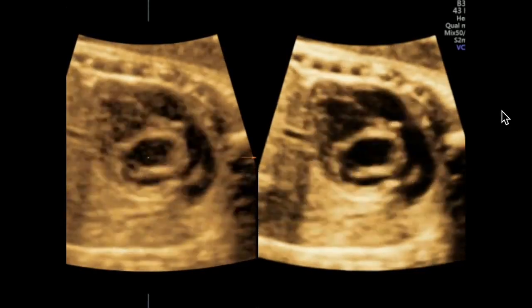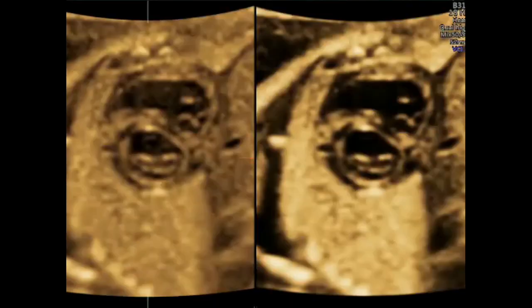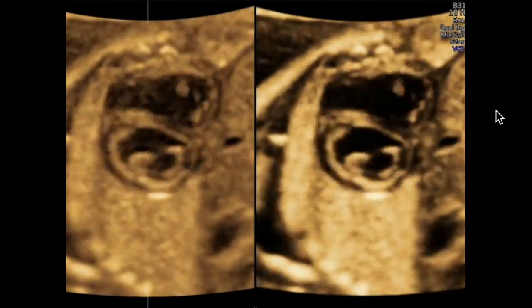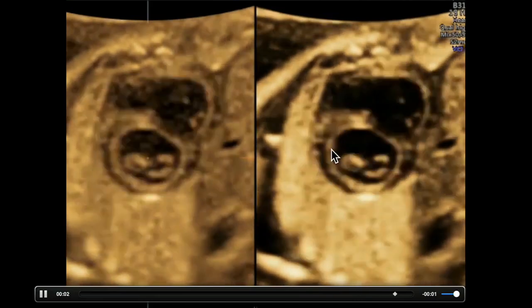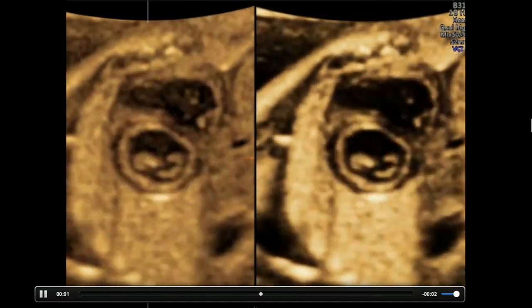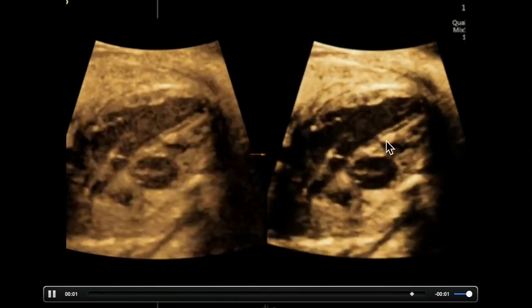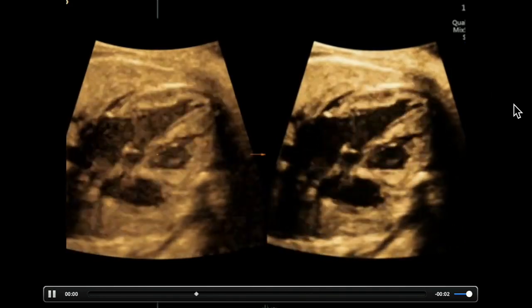Better assessment of ductal arch and vasculature, especially LPA and ductal branches. Here, Norm should love this one. This is how tissue contrast between two tissues that often appear isoechoic is improved with this. Norm talked yesterday about ratio of compacted to non-compacted myocardium, and I think you can see that this technology really enhances your ability to pick that up. Here again is a VSD with your 2D eye that you're going to pick up without the benefit of color flow by using this.